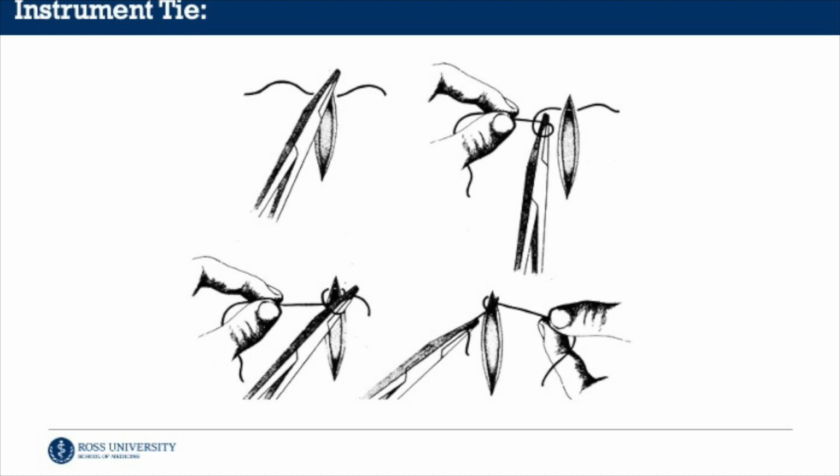Your hands will be able to pull the needle driver and suture in opposite directions again. Cinch down on the suture to leave the wound edges everted but not too tight, strangulating the tissue. This is the complete surgeon's knot, which required 2 separate motions.